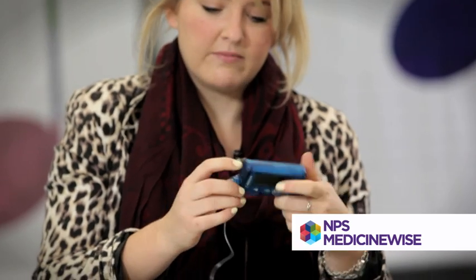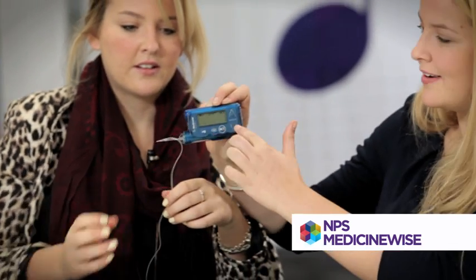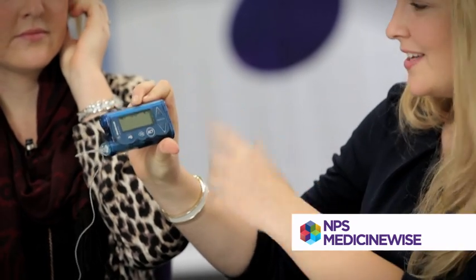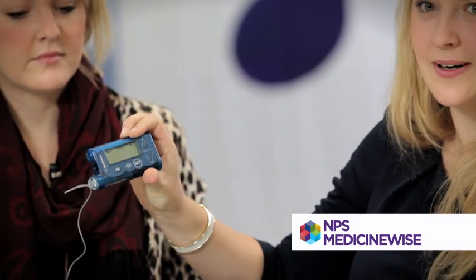That's pretty much it. It's just controlled with the keypad, so you go up to increase the insulin, go down to decrease it. It's really straightforward, and then you just press the button to inject.